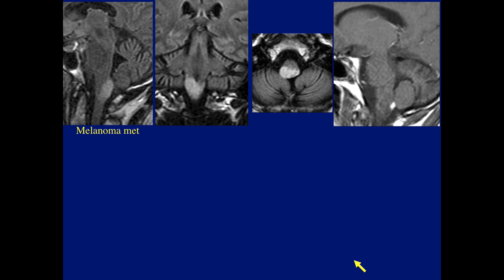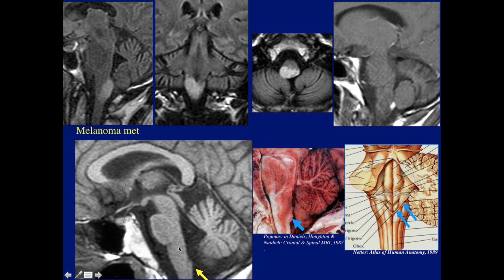This is a patient with a melanoma metastasis involving the clava — remember, the clava is where the tubercles of the fasciculus gracilis and cuneate sit. Here it is on a sagittal image, markedly expanded by the metastatic melanoma, and here it is on axial.